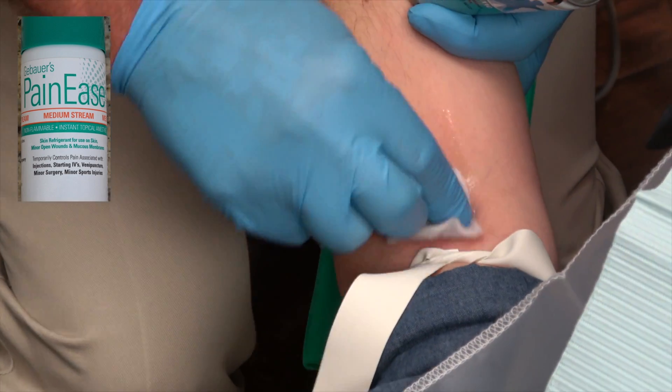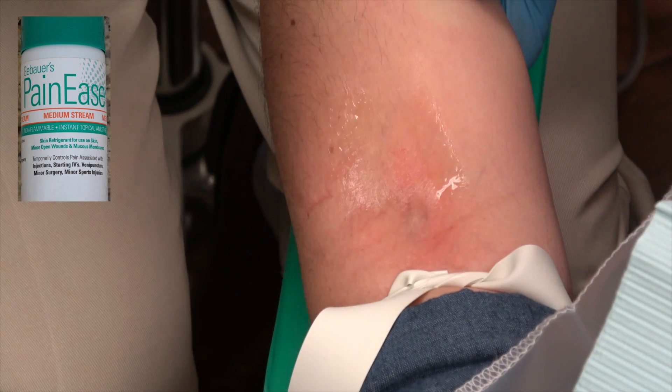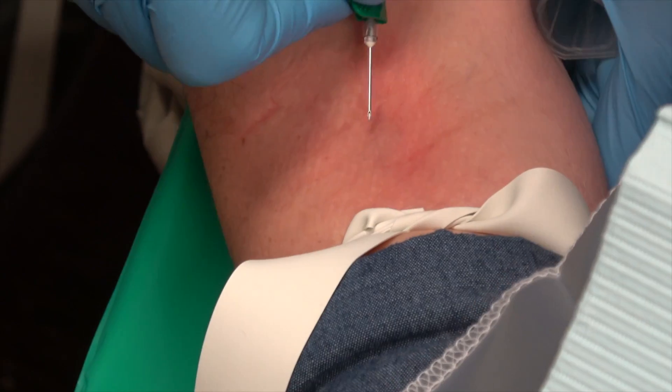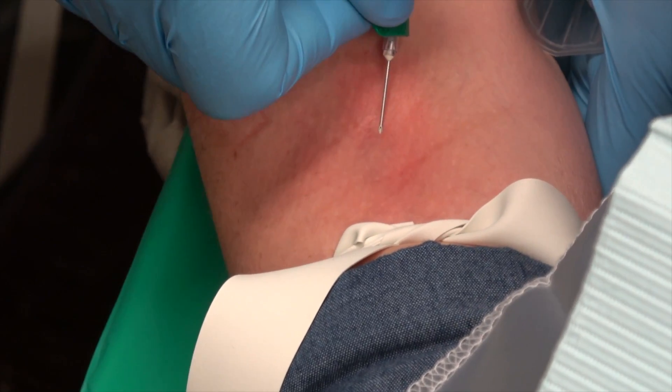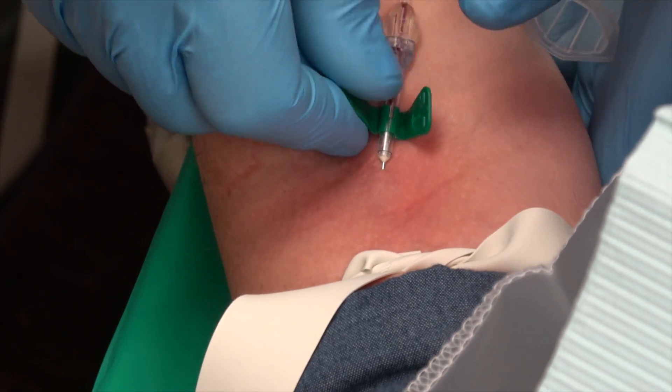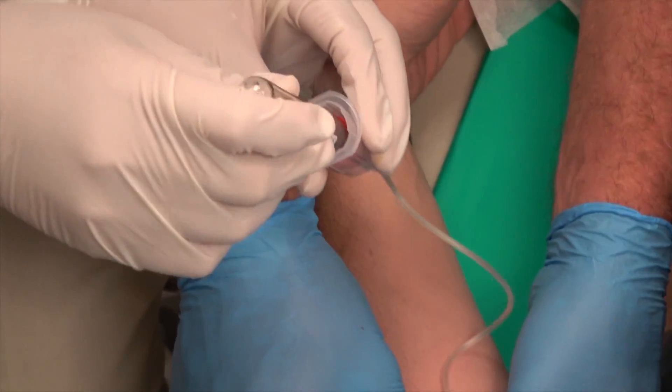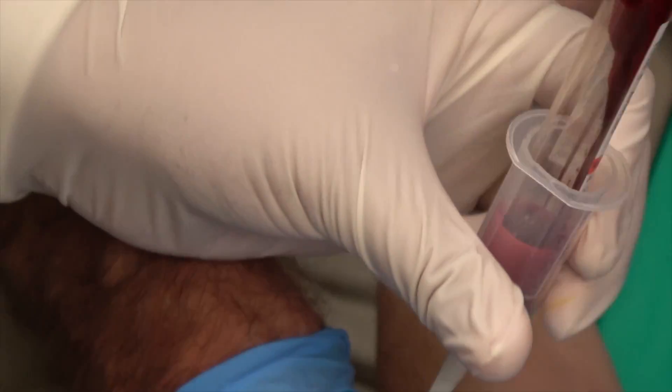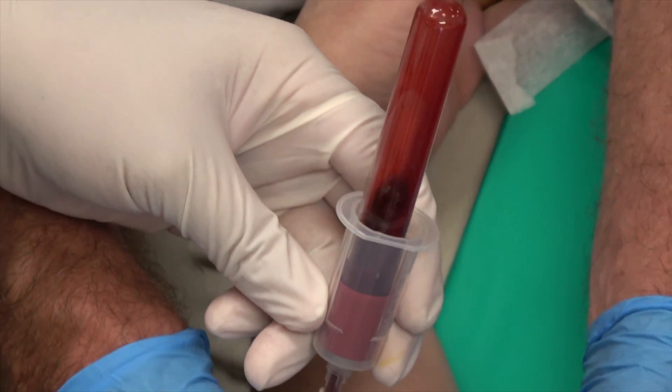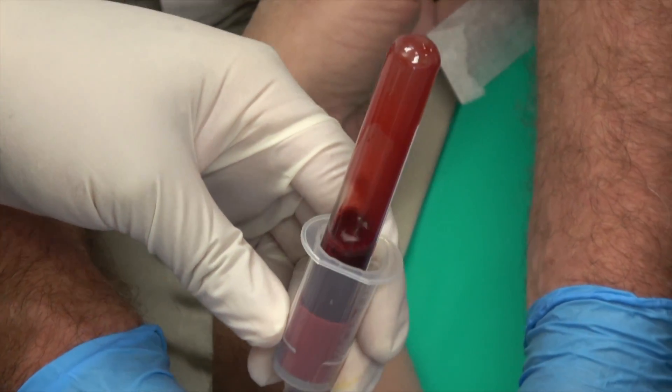First, we're going to perform a phlebotomy and draw blood from the patient into these vacuum vials. And normally, you'll draw at least two, sometimes four, sometimes six. These vials have a negative pressure, and they draw the blood into the vial.